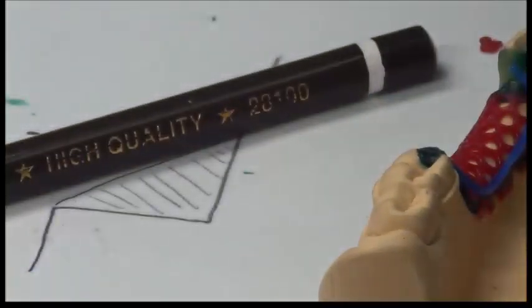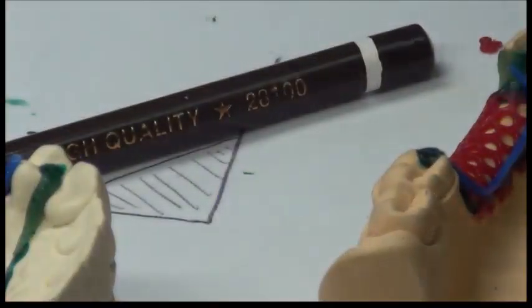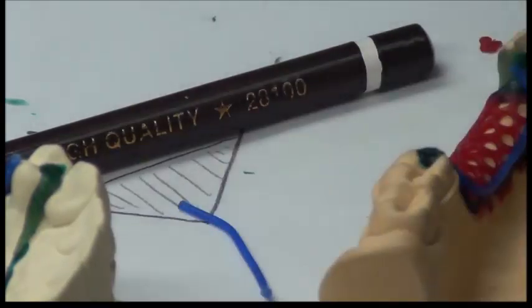Try not to touch the rod itself. Clear enough to add it with. See, I have clearance. I'm going to add it here. Here they don't meet. I have enough thickness for the new tube to be added. Now what are we going to do now? Just add, as I told you, molten wax and blend them together. This one, no, need more. No, this triangle is not here.